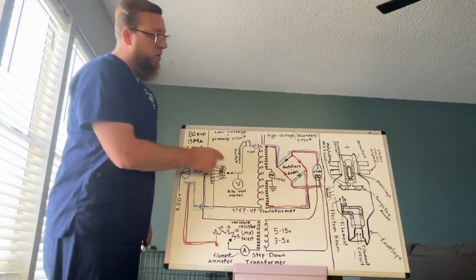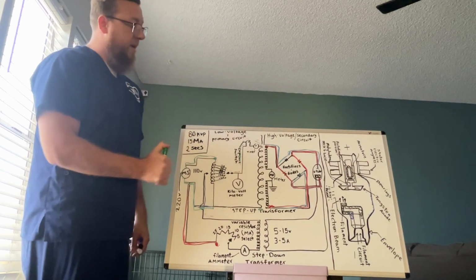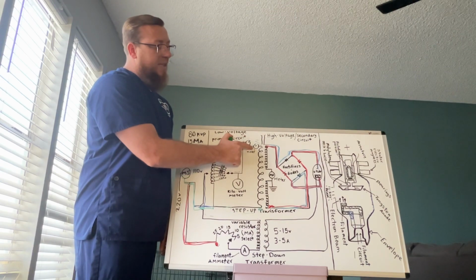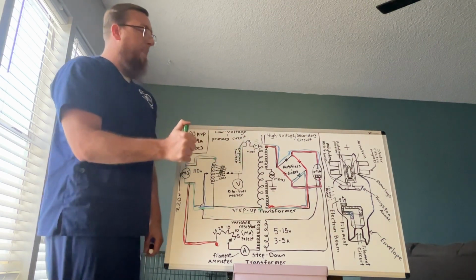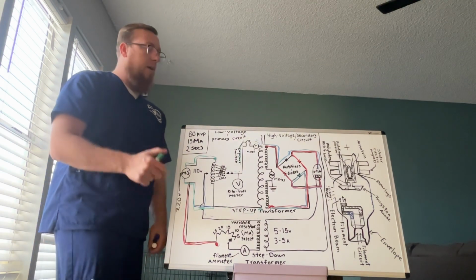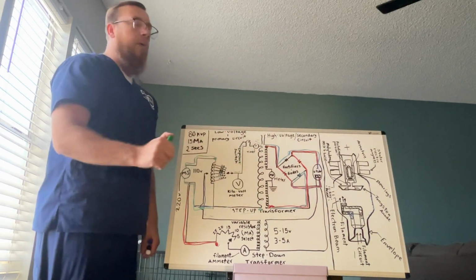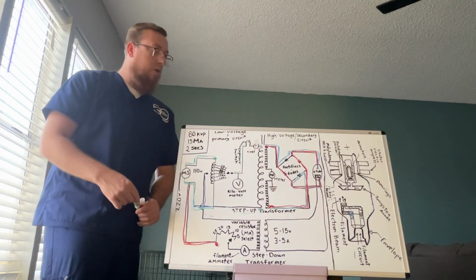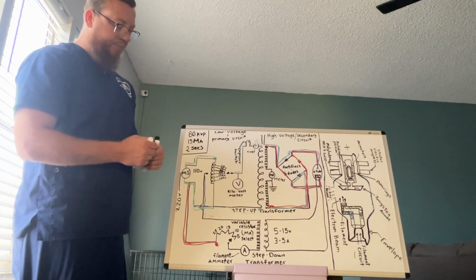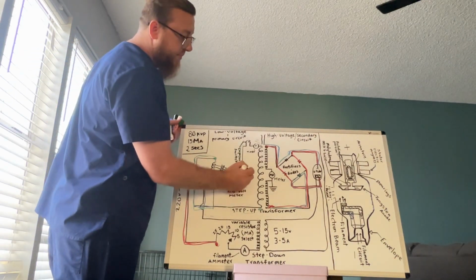So when I hit the exposure switch, if this is my exposure switch, I'll press down on my exposure switch. After the 2 seconds of exposure has happened, I will get a blinking sound and a blinking light to let me know that the 2 seconds is up. I will then let my finger off the exposure switch, and at that moment what's going to happen, if you remember, all this is flowing at 110 volts.